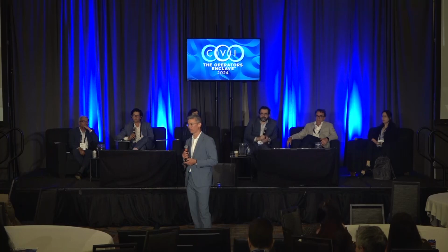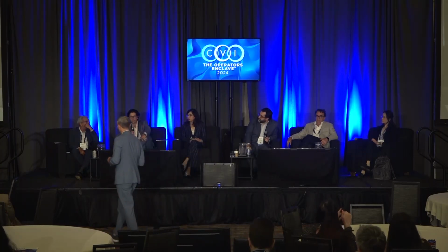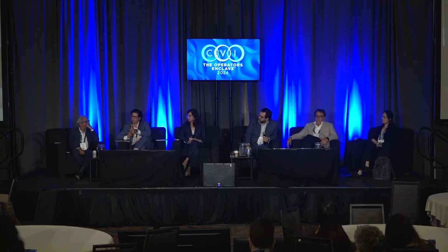Yeah. So Jason, I've got a question. It seems that from at least the case you showed, the device animation, that complex morphology at the distal lobe will be less of an issue with this, because it doesn't really matter what's happening right in the distal bag, to use your analogy. So that appears to be helpful. The fact that you're closing at the ostium, one hopes that peri-device leak is less, and then the residual footprint seems very little, so hopefully DRT is less. Are those the 3 advantages of this compared to what we have available at the moment?